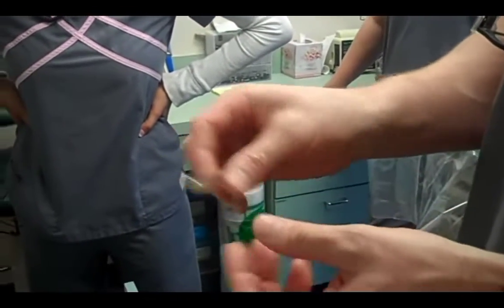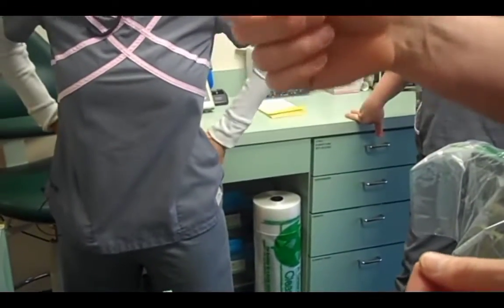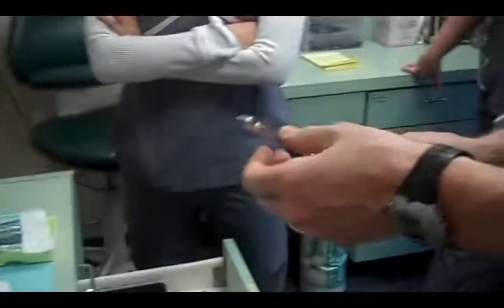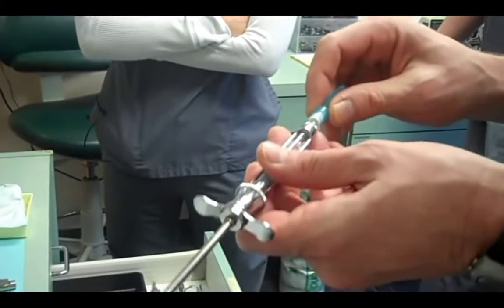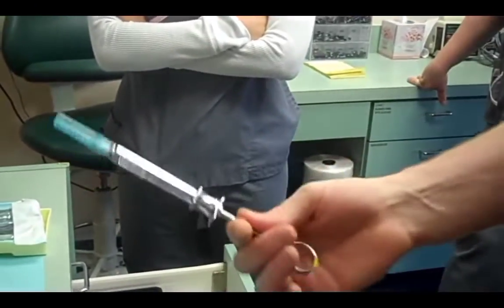That means if we're going to do any upper tooth and every single lower tooth except for lower molars, we're going to use septicaine. We're going to use septicaine in a regular syringe, place it like that, and we're going to use a 30-gauge needle, which is a blue. Whenever you load this, load it just like that.